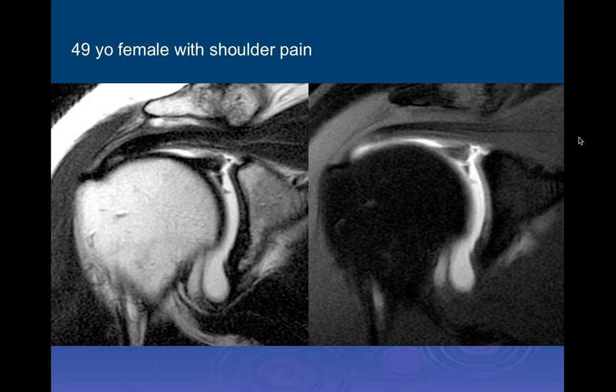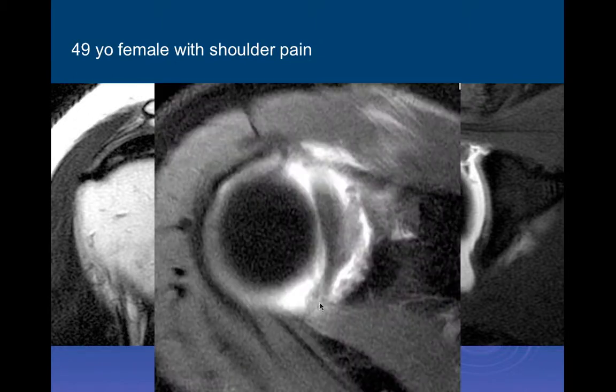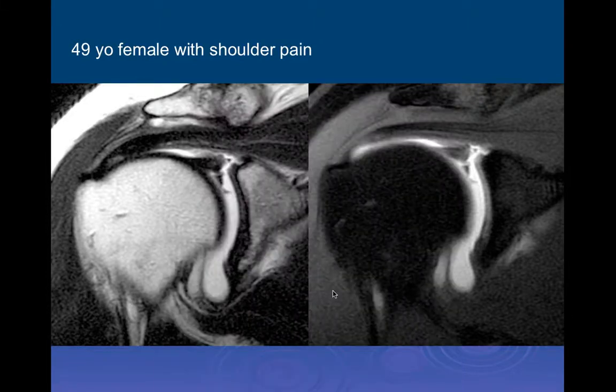If you described it so that the referring physician could give a type, say they like typing the tears, why don't you describe it so that the referring physician can tell you what SLAP type it is? Sure. I think it extends both anterior and posterior to the biceps anchor, which we see on the axial image here. Okay. So there's the biceps, here's the biceps anchor. Therefore, it's a type 2C.